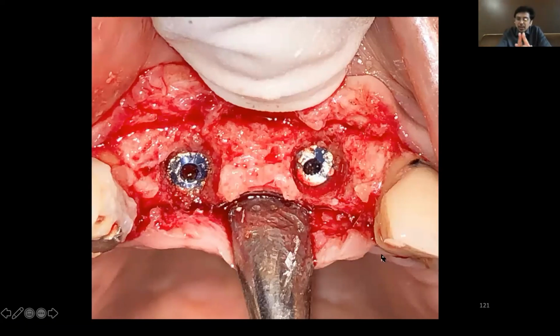Okay. So this is the maximum success. This is considered to be a success in implantology in the sense that my implants not only survived, actually bone growth occurred on top of the implant in a case in which a large periapical pathology was there to begin with. Are you getting a point? So this can be achieved only and only by using good materials, biologically good materials, not company-wise good materials, and good surgical skills. Primary closure is the key.